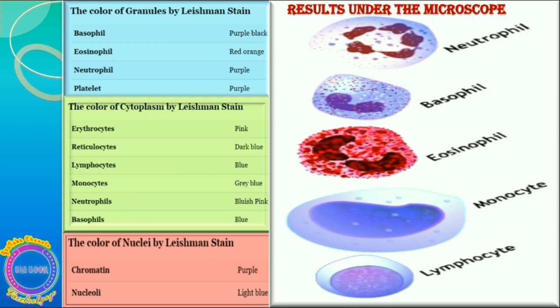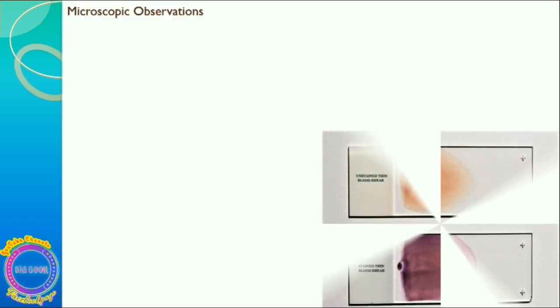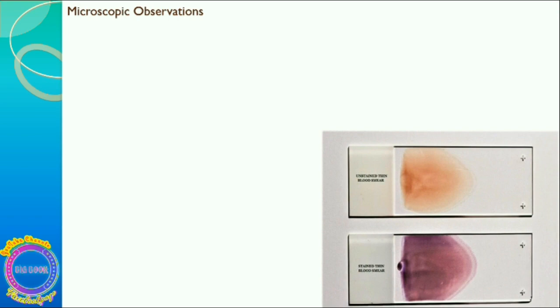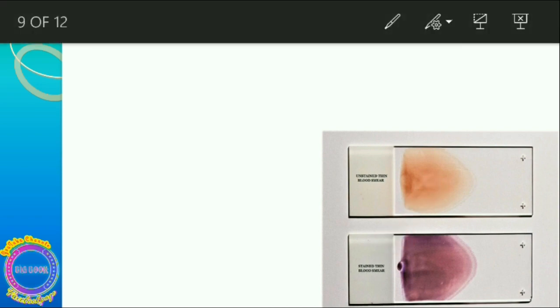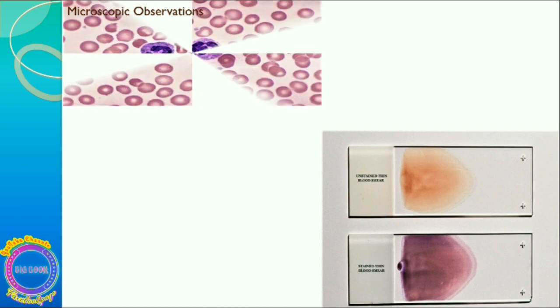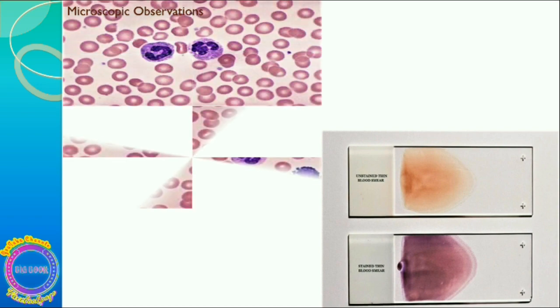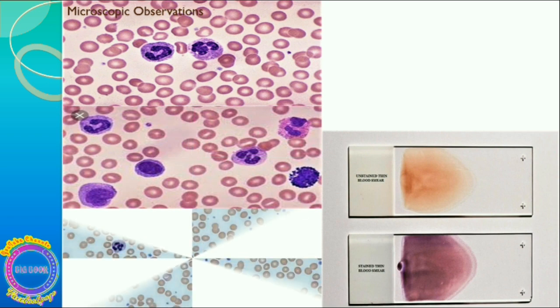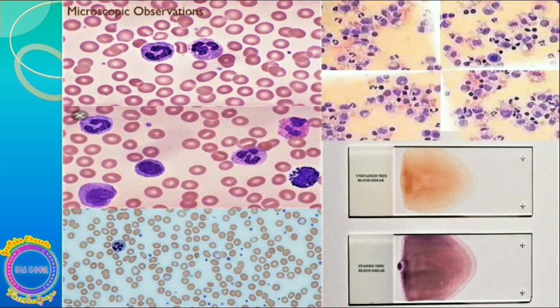For microscopic observations, the first image shows a blood smear without stain, the second shows the blood smear after staining, and the third shows a slide with WBCs visible. These images represent different zooming levels and resolutions, showing how the final slide should appear under the microscope.